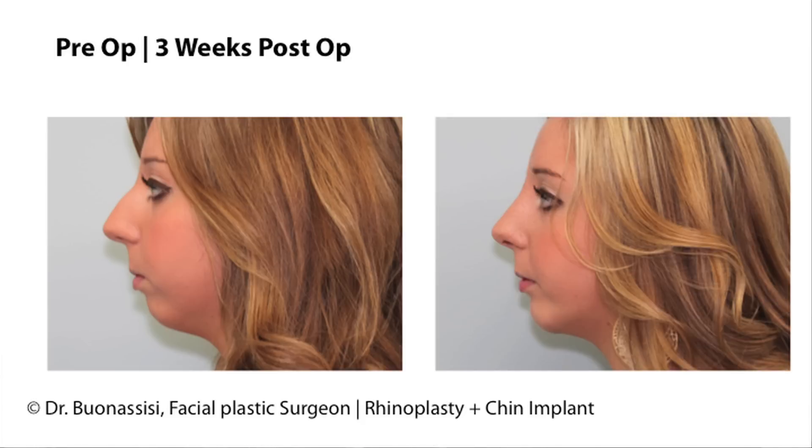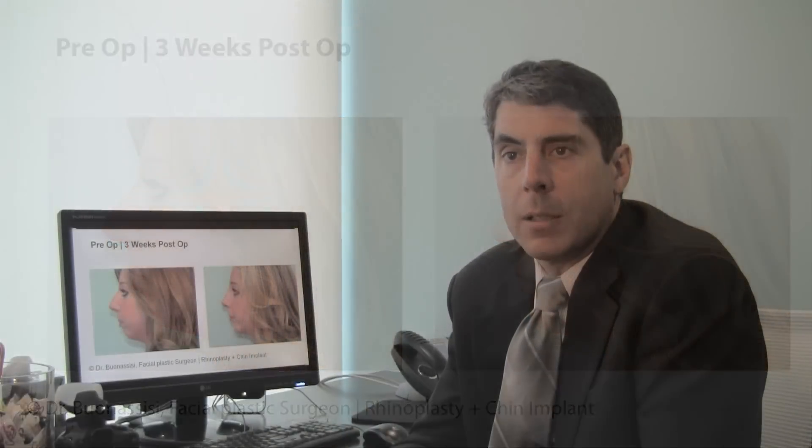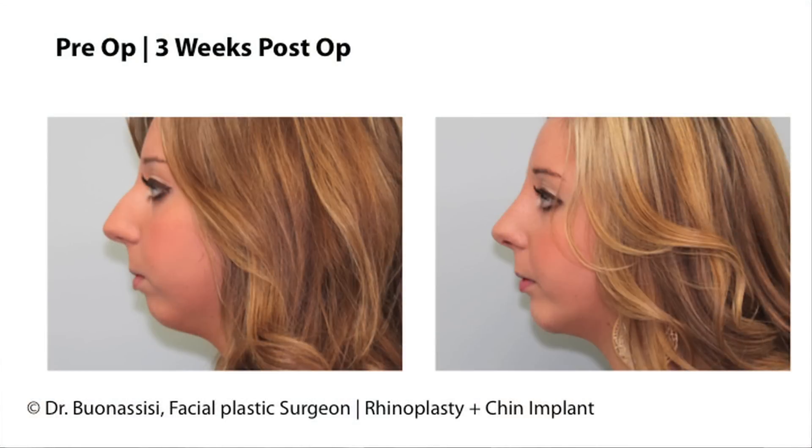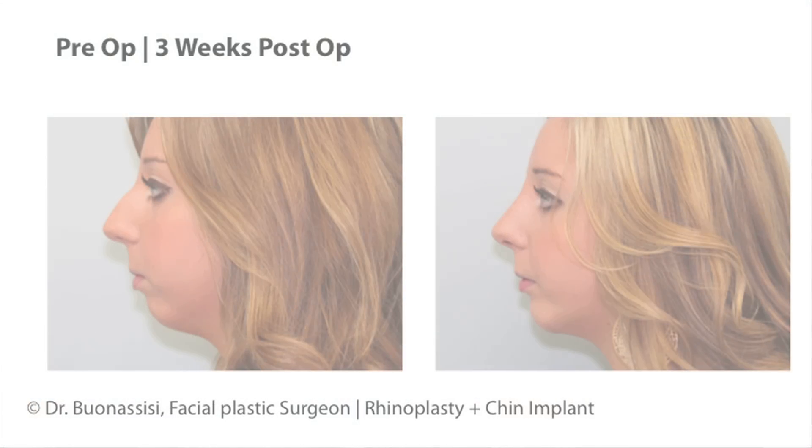We've advanced her chin through a small submental incision. We've put in a medium-sized chin implant, and that's bringing her chin forward nicely so that it's in line with her forehead. We always want to be very cautious in women not to advance the chin too much. It's always good to be conservative with the augmentation in women. You'll notice as well that we've performed a rhinoplasty for her. It's quite a common combination.